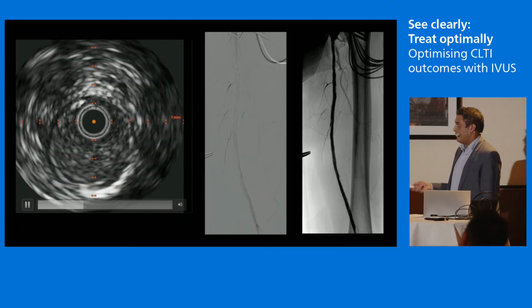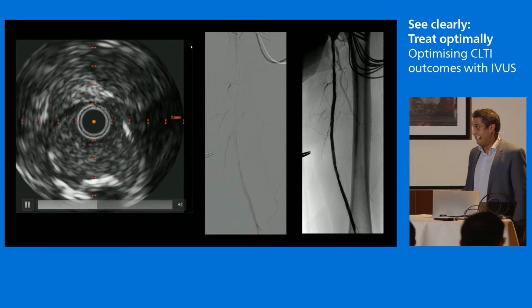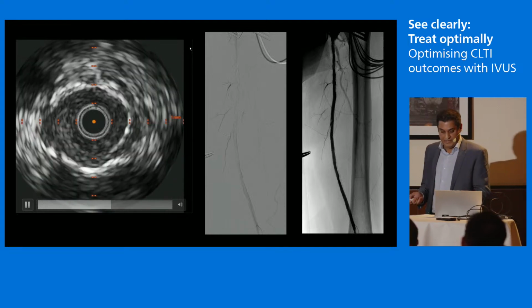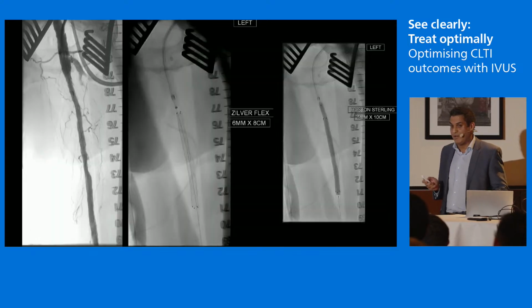But, you know, in years gone by, I would have left that and I would have been quite happy with that, especially with a long CTO. In a hybrid case, you're already sort of 4 hours in. But this isn't something that you should leave behind. We've seen that quite a few times now. And if you put the chromo flow on it, there's no actual flow in there. There's no chroma flow, although we're not quite sure what that means.